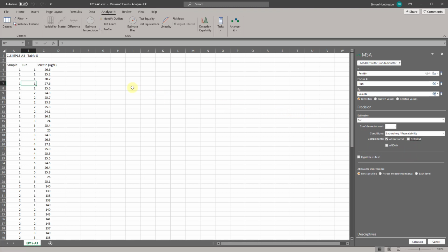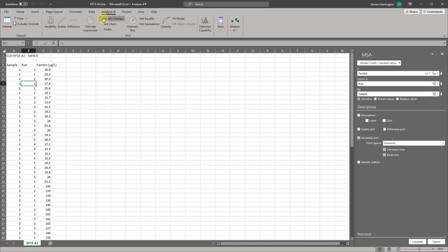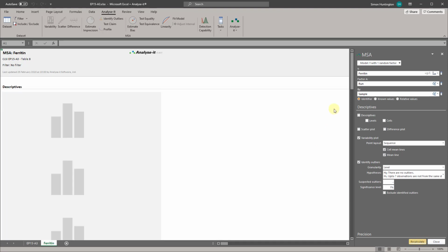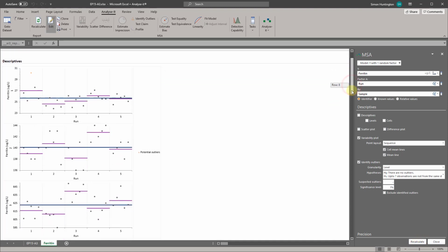On the Analyse-it ribbon tab, in the MSA group, click Variability Plot and also click Identify Outliers. So after all that, we can just click Calculate, and the analysis report opens. Now, let's look at the results.